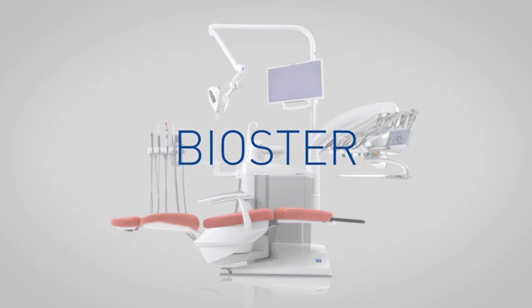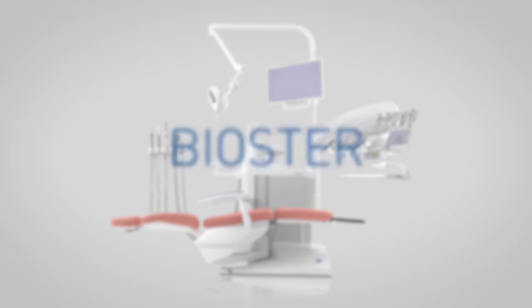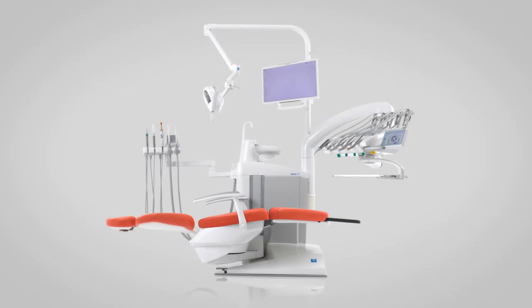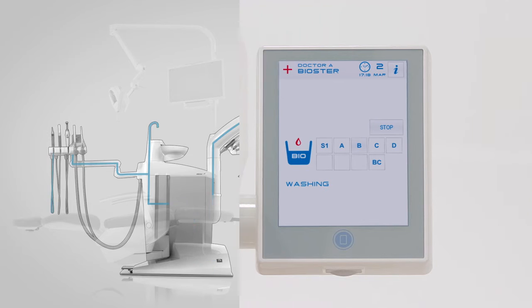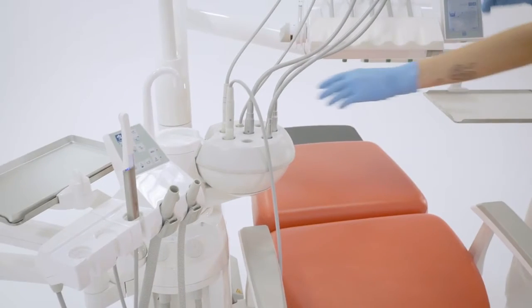The fully automatic Bioster system allows for fast running of dental unit water circuit disinfection cycles with 3% hydrogen peroxide-based disinfectant. The following steps are performed: emptying the instrument's water circuits, introducing liquid disinfectant and starting the disinfectant contact time until the required value is reached, and emptying the disinfectant and rinsing of the circuits. At cycle end, the full-touch control panel displays the message: end of cycle, put back instruments.